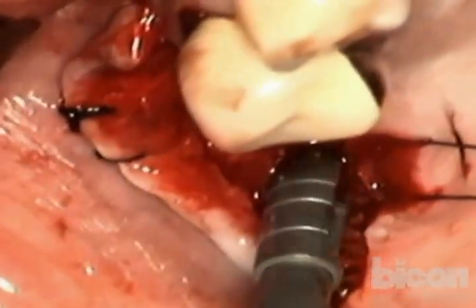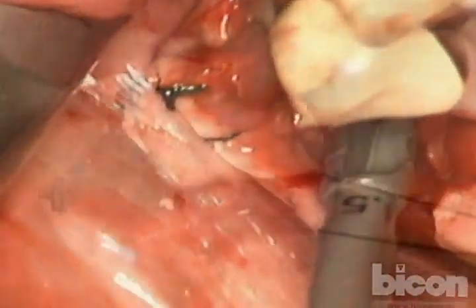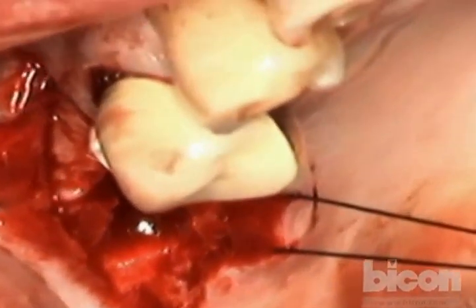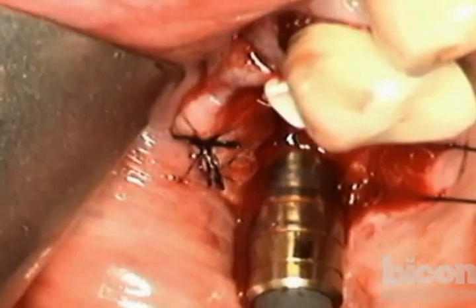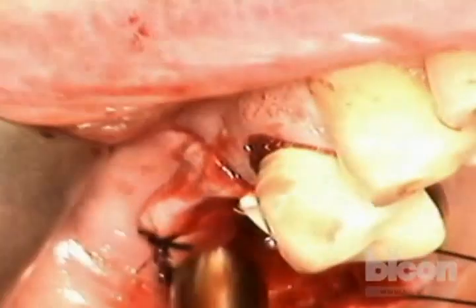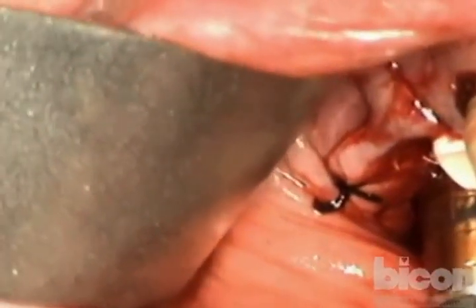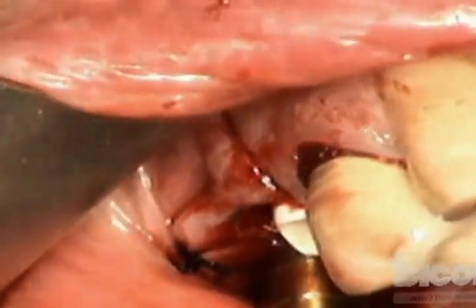And I can still feel the floor of the sinus there. It's that deep. And this is also a site expander at 5 millimeters. The goal is to go to 6 millimeter in the posterior. Time, watch. You're his head. It's okay. All right, good. And so now the mesial implant is prepared.